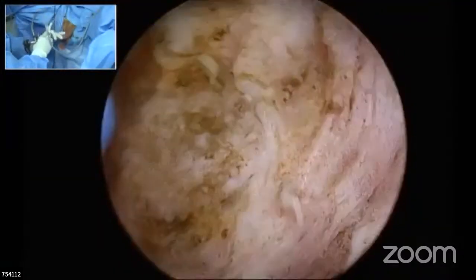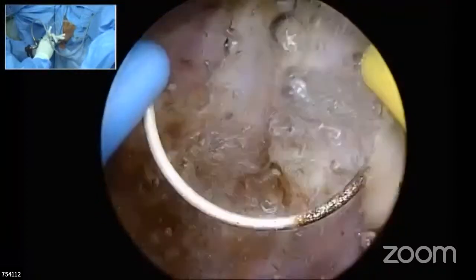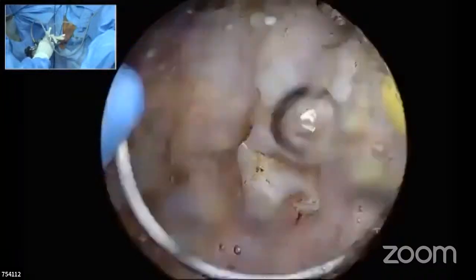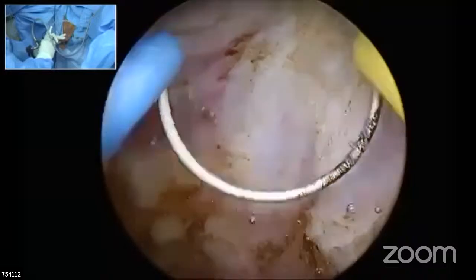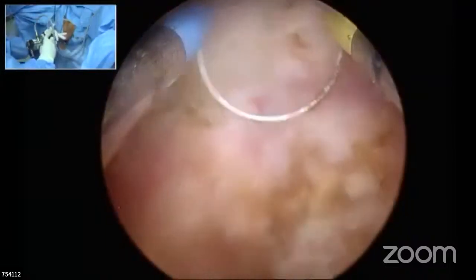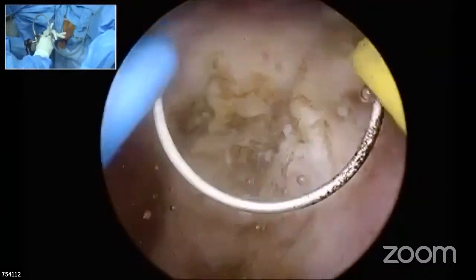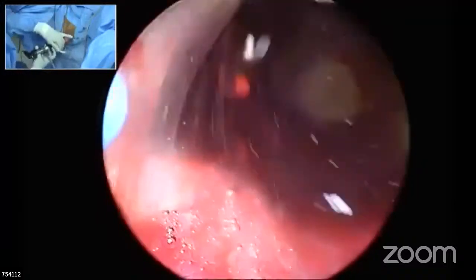Another point is, whenever you are reaching the capsule while resecting, there is a muscular movement which comes in. You saw that muscular movement behind? That muscular movement means you are near the capsule. Never cut, because that muscular movement sometimes moves the capsule towards you, and you may ultimately come out of the capsule also. So beware of that muscular movement. Whenever you see it, you stop.